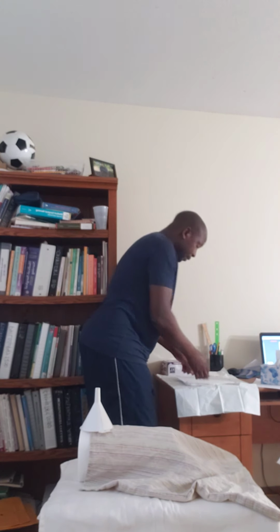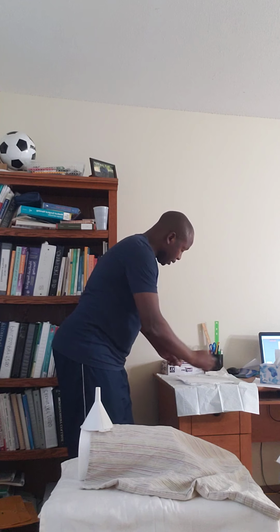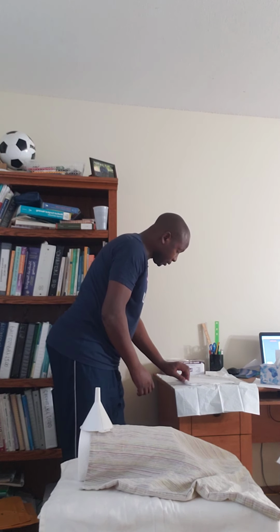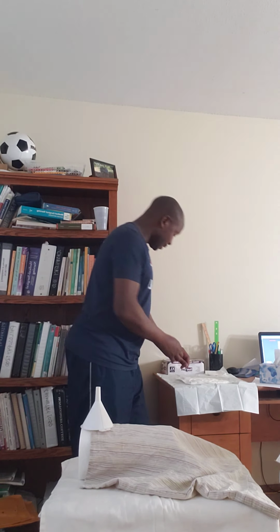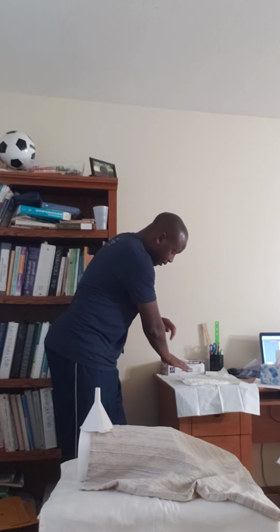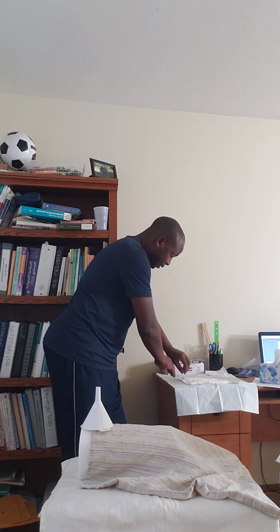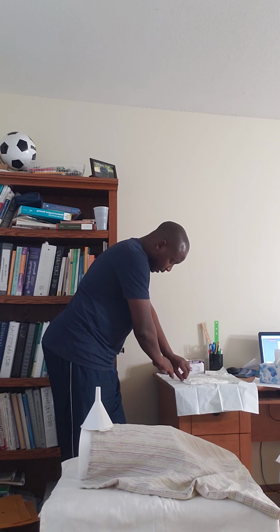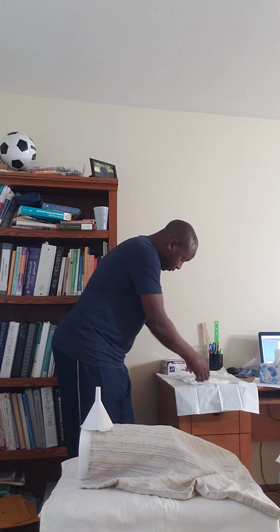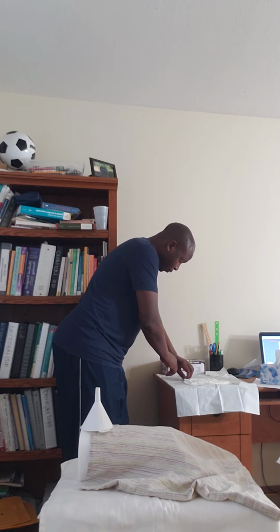So when they're sterile, then I open my gloves. When I open my gloves, I go away, this way, come this way, and then it lasts to me. Because I washed my hands, I can start with whichever hand I want, whether left or right. It's okay if I touch at the beginning. I'm going to protect the gloves, which are in the middle, not at the edge of my surroundings. So I'm going to put them over here.